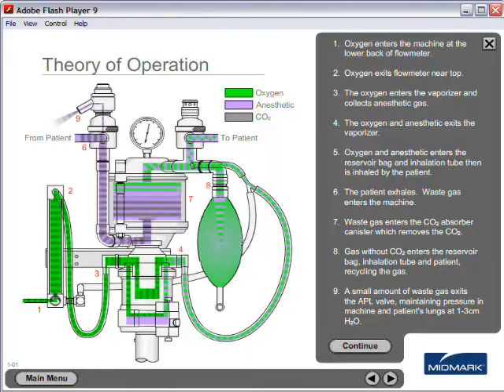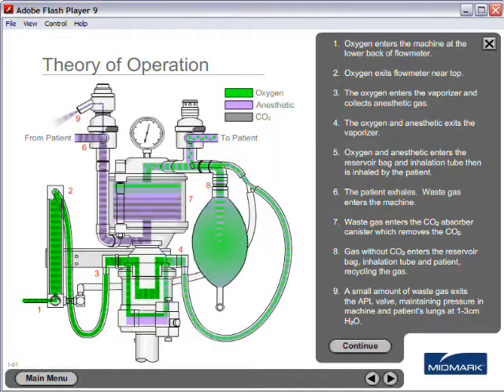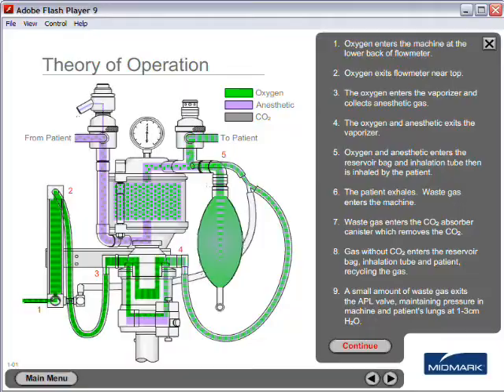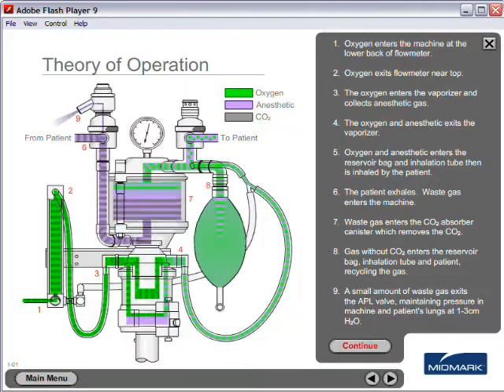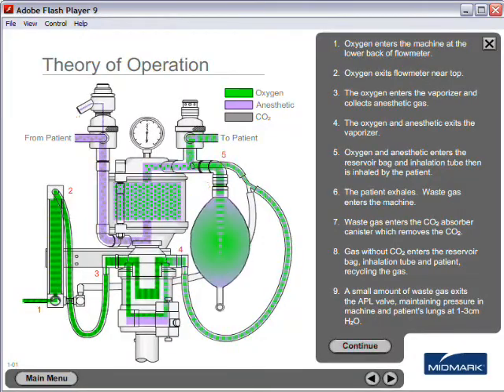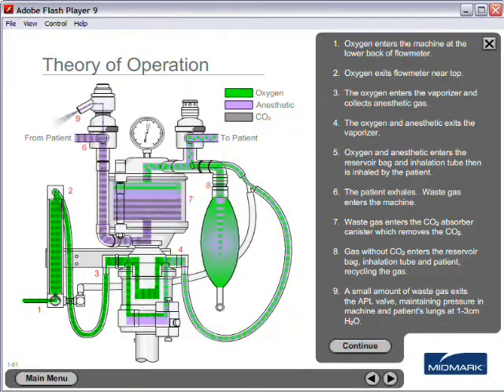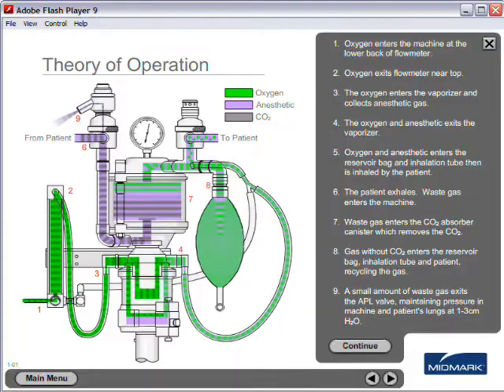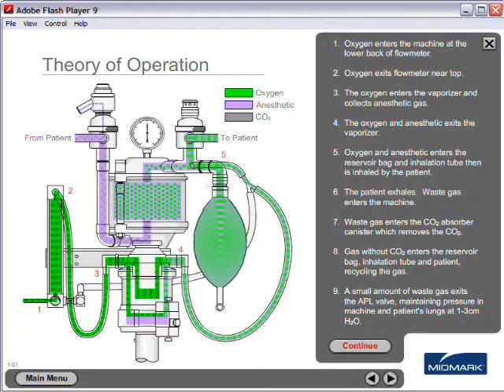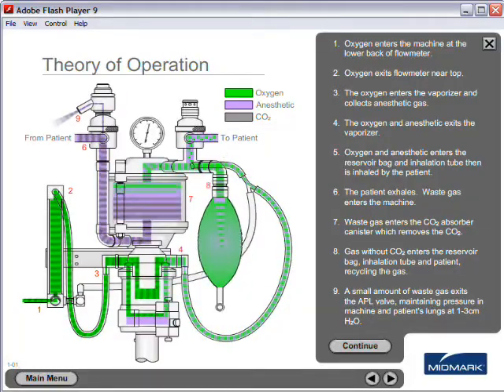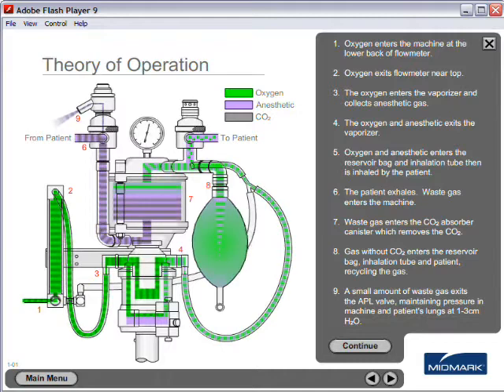Waste gas enters the CO2 absorber canister which removes the CO2. Gas without CO2 then enters the reservoir bag and inhalation tube, recycling the gas back to the patient.